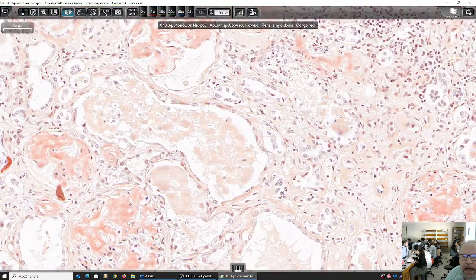Not the glomeruli with the amyloid, this structure here. What can this be? It has a lumen, and the lining is flattened because this is a microcystically dilated structure. What structure can this be? It has no amyloid deposition, however, it is damaged. What can this structure be?